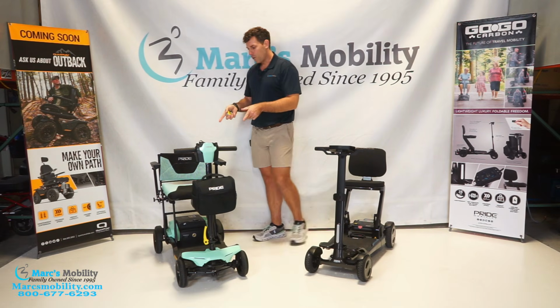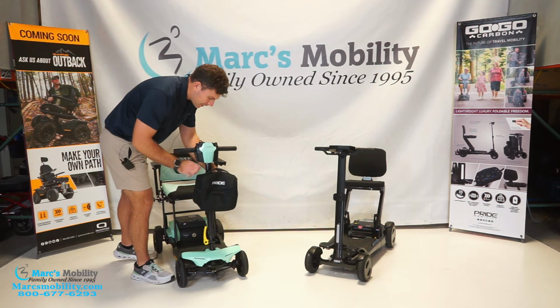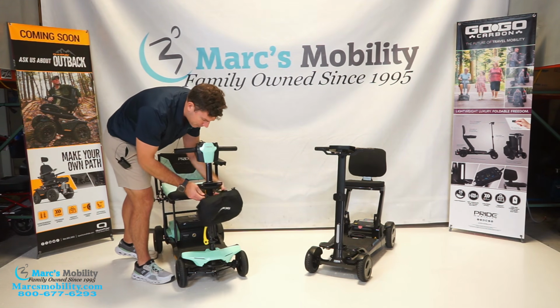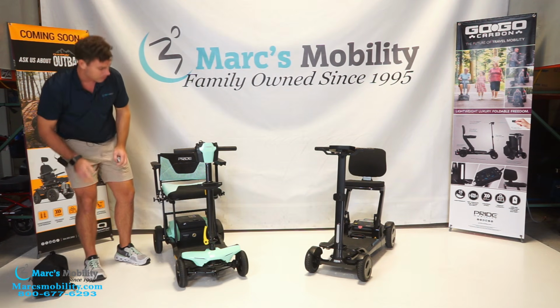Now we're going to go over the folding of the Super Portable. The first thing I would typically mention is to take your front basket off. This is not necessary, but if you do have stuff in your front basket, you want to make sure it is zipped up. You can leave this on. I'm just going to take it off right now for the video demonstration.